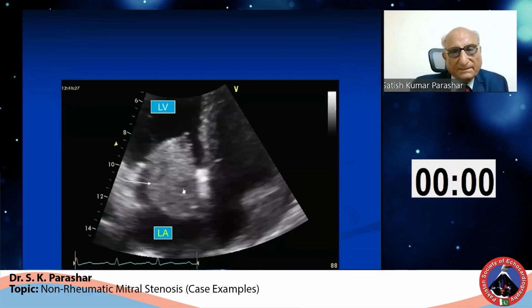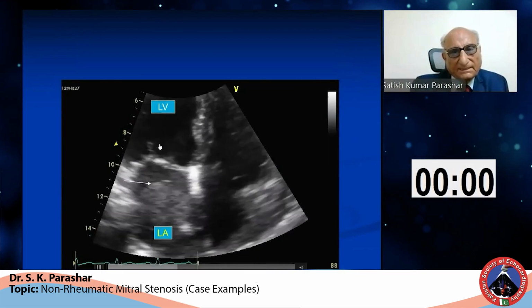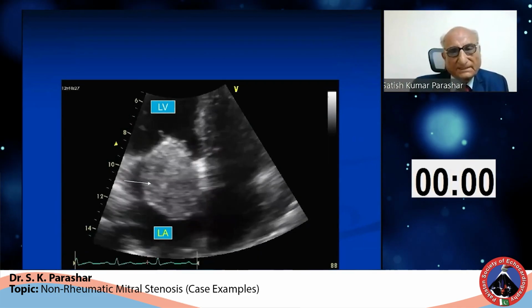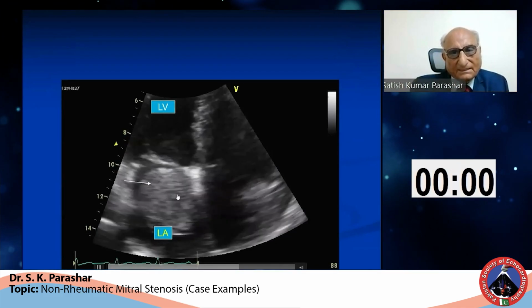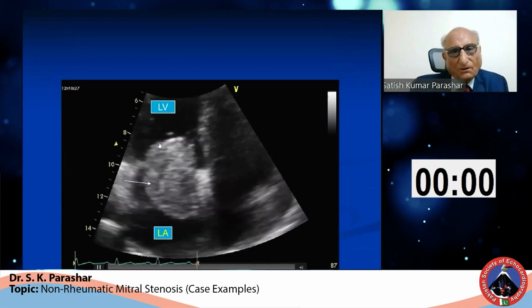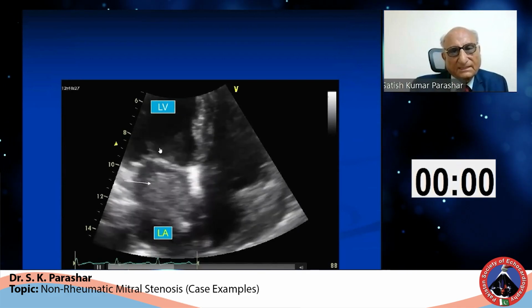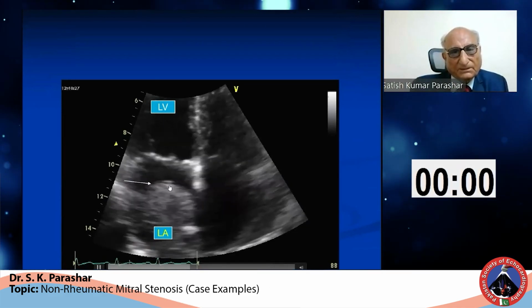Again, the same thing. Now this is an atrial myxoma. You see, it goes into the mitral valve during diastole. Many of these cases are only diagnosed as mitral stenosis, and these tumors are detected routinely. When they obstruct the valve, they produce a functional stenosis, and thereby there is a variable murmur depending upon the posture also.